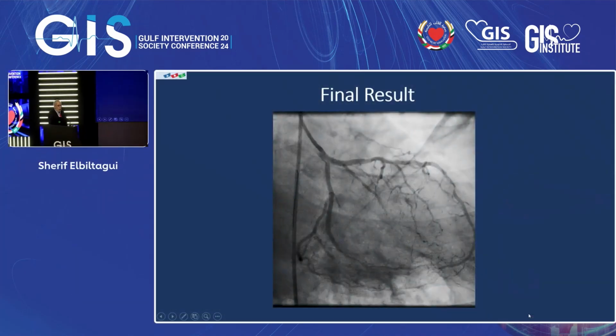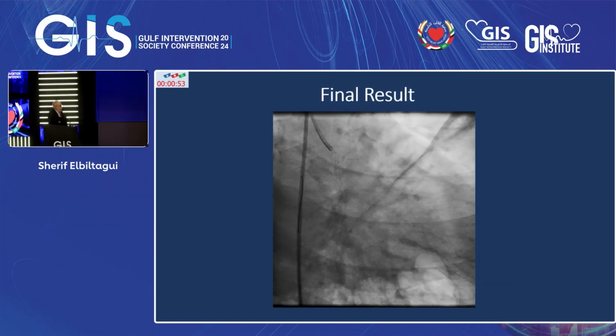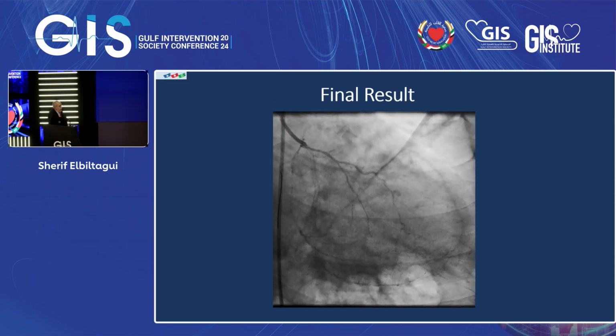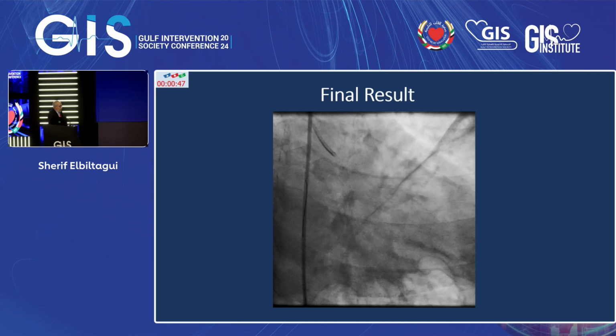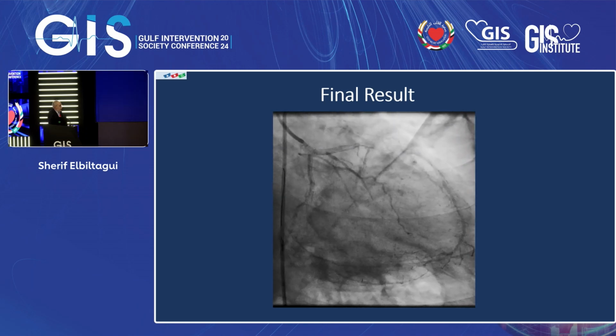So, Mr. Chairman, dear colleagues, I can simply give a message that such a simple tool as the angulated microcatheter is underused, but it is sometimes very useful, and I believe in ostial CTOs, it is crucial. So I just advise it be a part of any CTO toolbox.